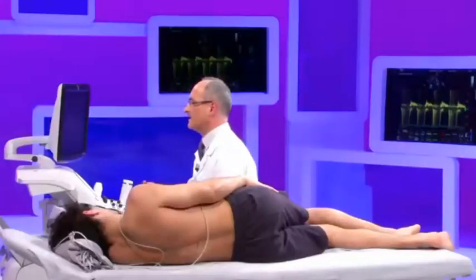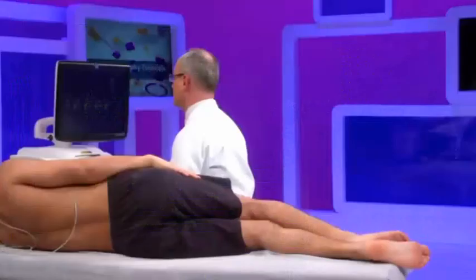Then it may be useful, particularly in patients with heart transplant, if there is anything changed from a previous examination, to look also at the diastolic function of the right ventricle, just sampling the inflow of the right ventricle, as I did now.